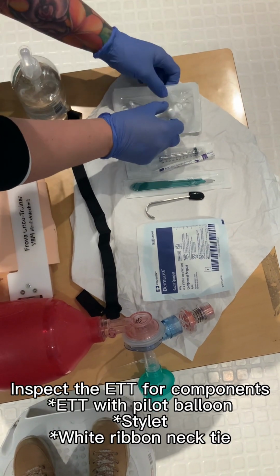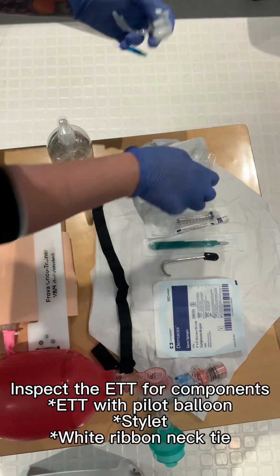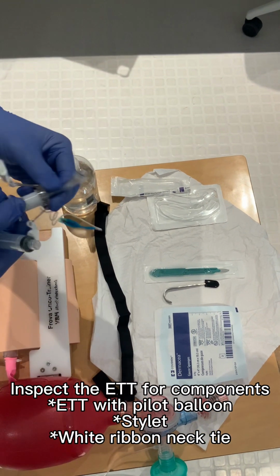Inspect the ETT for components. You should have an ETT with a pilot balloon, a stylet inside the ETT, and a white ribbon necktie. These are shown in the demonstration.